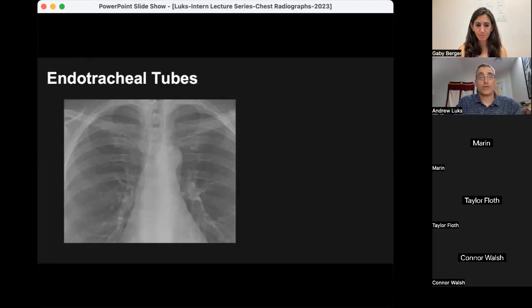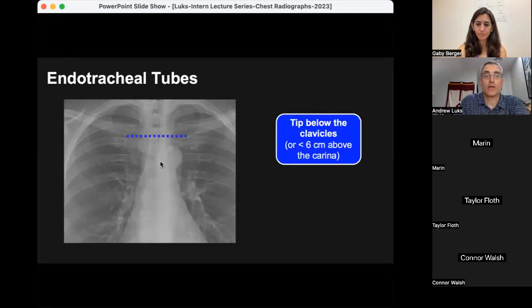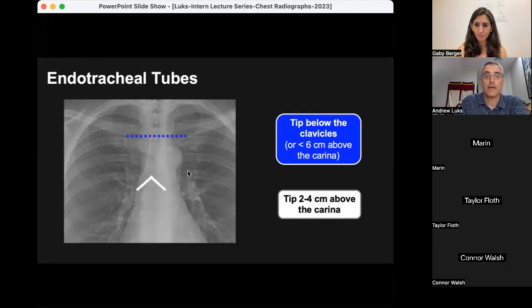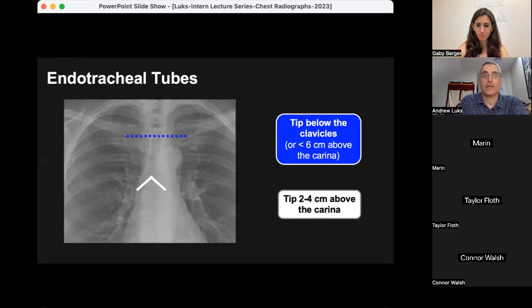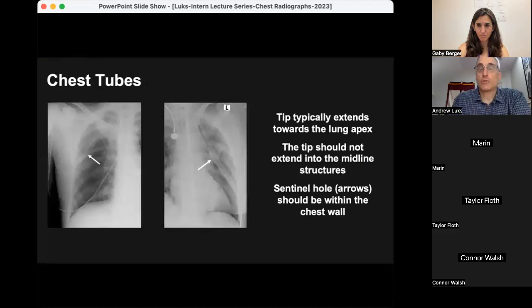Endotracheal tubes are inserted in patients who decompensate on acute care, get intubated in the ED or the field, or in the ICU. It's often your job to confirm that the tip is in an appropriate position. You want the tip to be below the clavicle — no more than about six centimeters above the carina — and about two to four centimeters above the carina itself. Endotracheal tubes that are too high risk unplanned extubation; tubes that are too deep risk main stem intubation. You want the tip generally in the zone of two to six centimeters above the carina, and if not, you'll be talking to the respiratory therapist about repositioning.